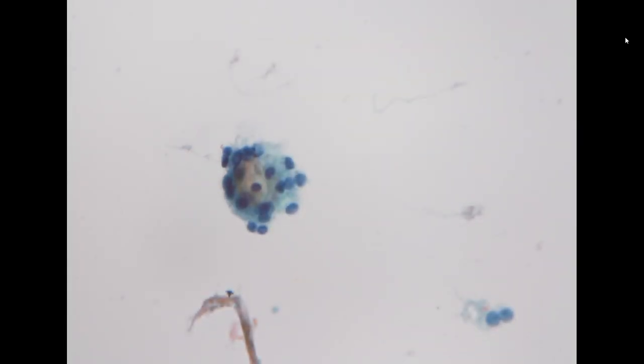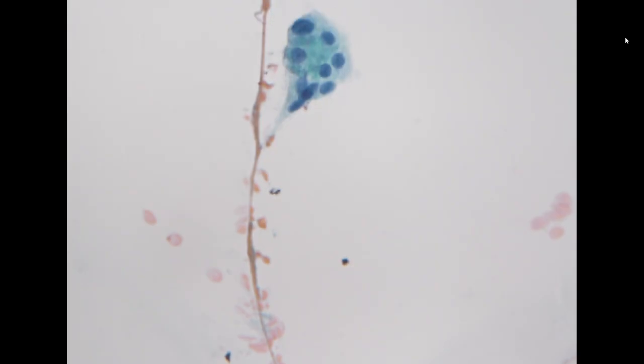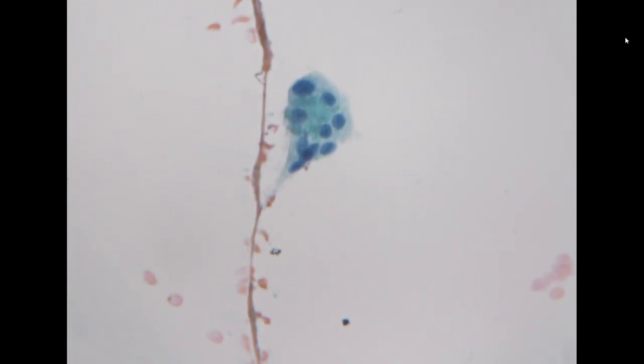I checked the sonography of the lesion. It is almost 4 centimeters, a well circumscribed nodule with capsule-like hypervascularity. So it looks like a follicular tumor. This could be a NIFTP or this could be a follicular adenoma.